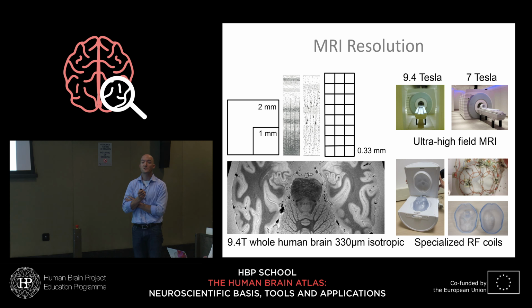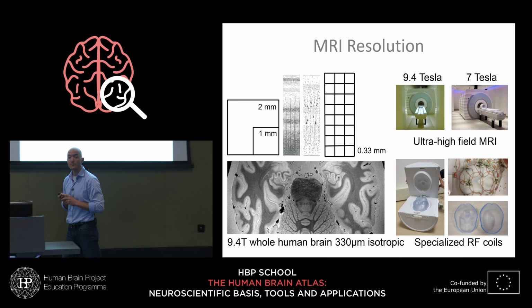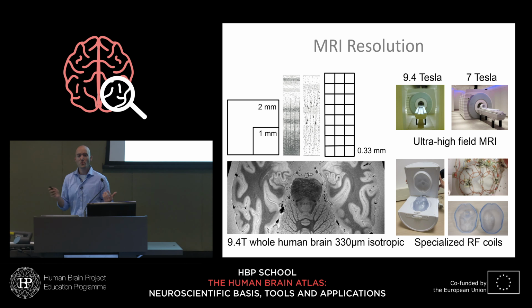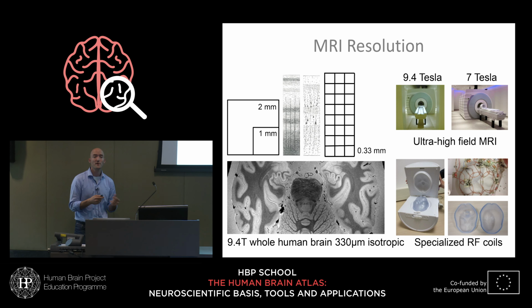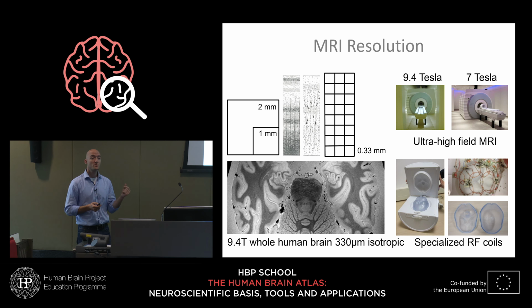Right away, of course, things that have their SNR, signal-to-noise ratio, rise linearly with the field, right? They will have twice the field, more than twice the SNR at 7 Tesla, more than 3 times the SNR at 9.4 Tesla, and so that takes a lot away of that nasty 27 factor. Not everything, but there's more tricks that we can play.